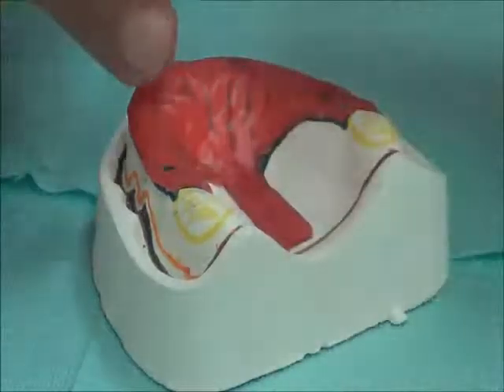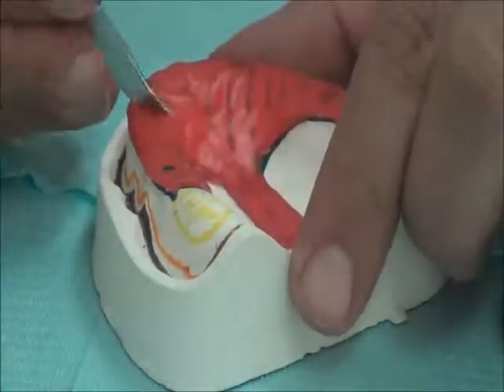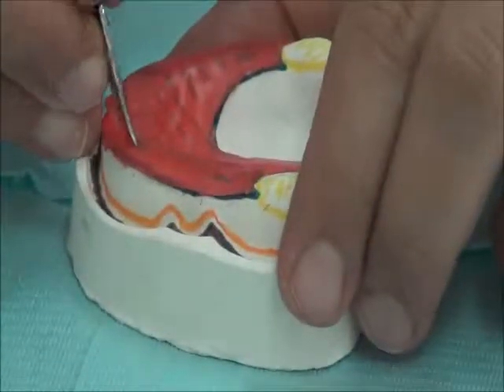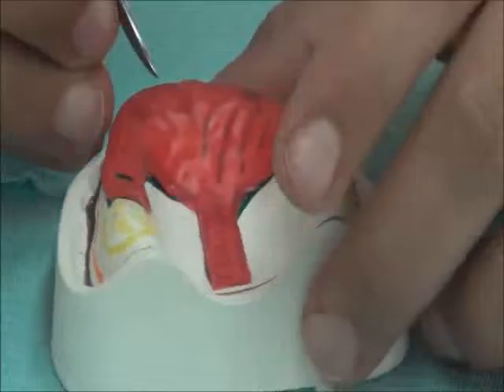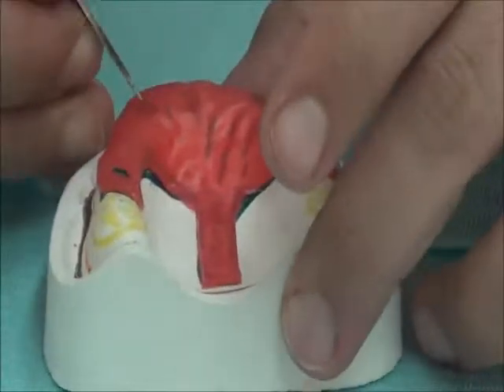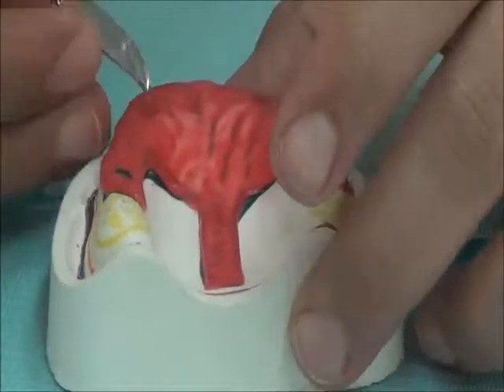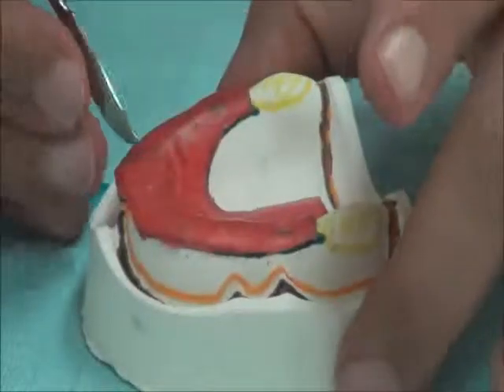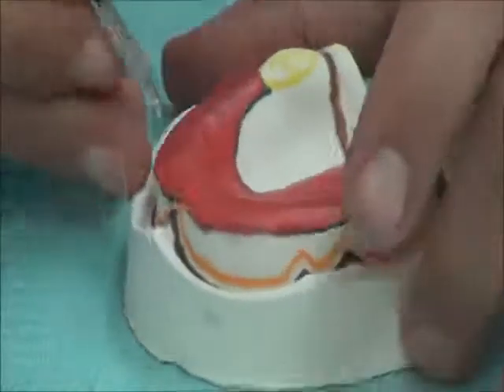If these stoppers are not there, the tray might tilt while taking the impression and we lose the space we have formulated or made in this cast. So tray material will stop here, maintaining the space.